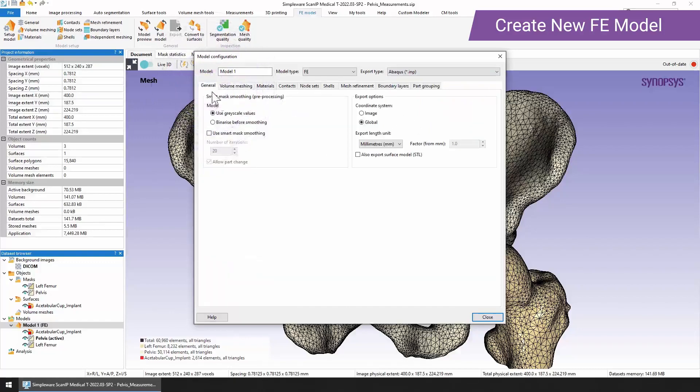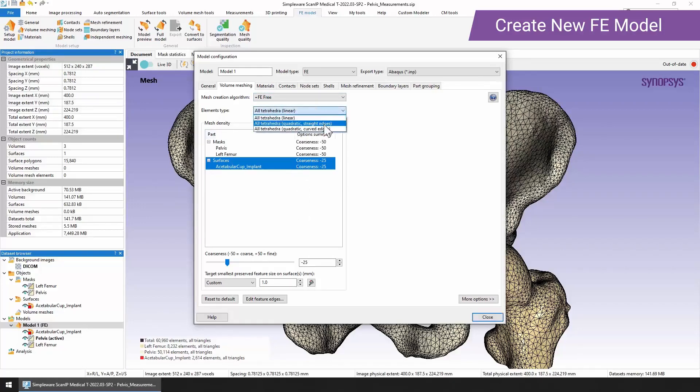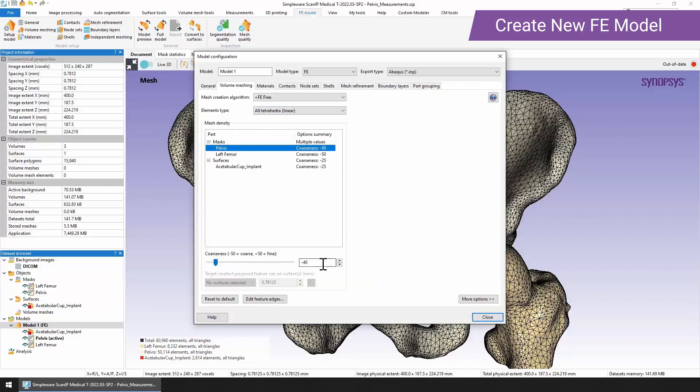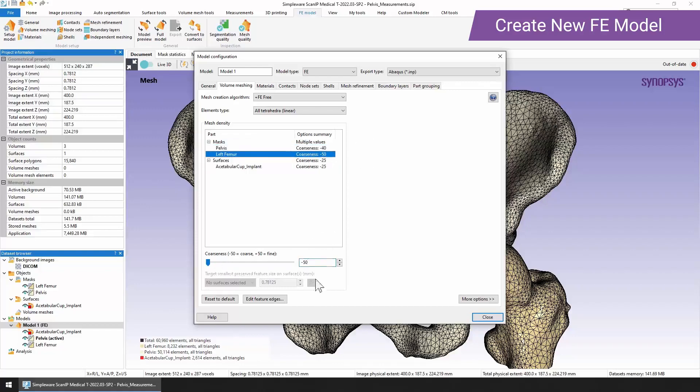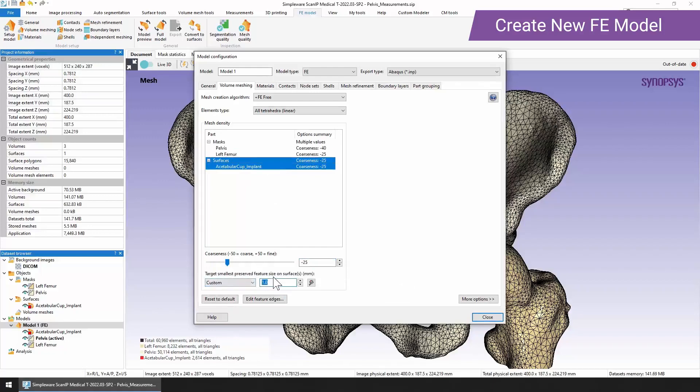A lot of the model configuration is very similar. We have the smart mask smoothing options again and the export options for the coordinate system and the export length. But when it comes to the meshing, we've got lots of different options that you can use here. I would suggest that you stick with the FE pre-meshing algorithm and use all tetrahedra. You do have the option to go for quadratic with straight or curved edges if that's interesting to you as well. We've again got the coarseness slider that we can use. Here we could set this to minus 30 for the pelvis and maybe minus 25 for the femur. And again, we've got the same slider for the acetabular cup. This time I might go for 0.8 as my smallest feature size that I want to keep.